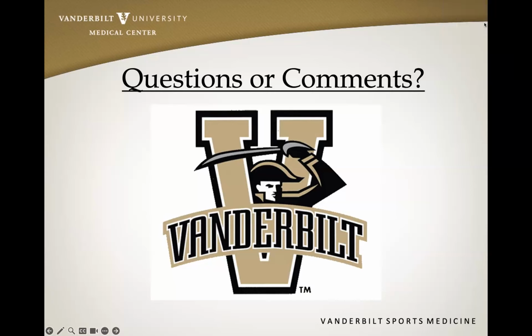Yeah, I think the side to side view that you did is super helpful. That really tells a story. I tend to measure a little bit lower in the joint, and the only reason I do it that way is because some of the standard values have been established on radiographs. And when you look at the radiographs, you're going to see that the most central bony contour is going to be where you take the measurement. So that's where I've done it in the past, but I don't know if that's correct.